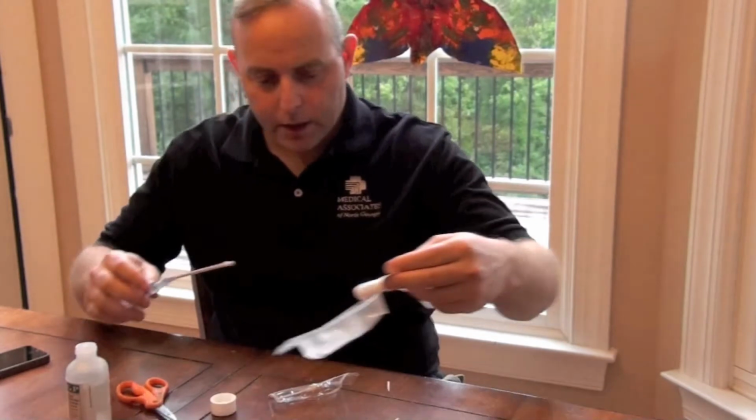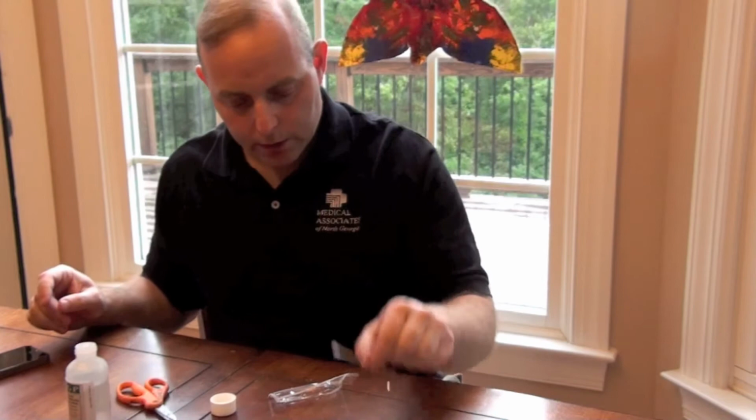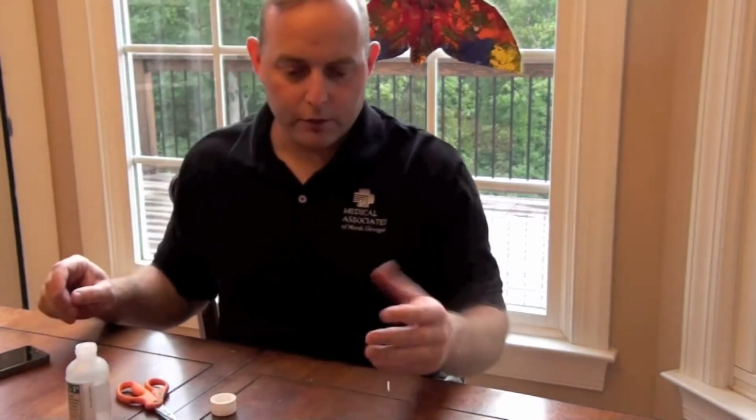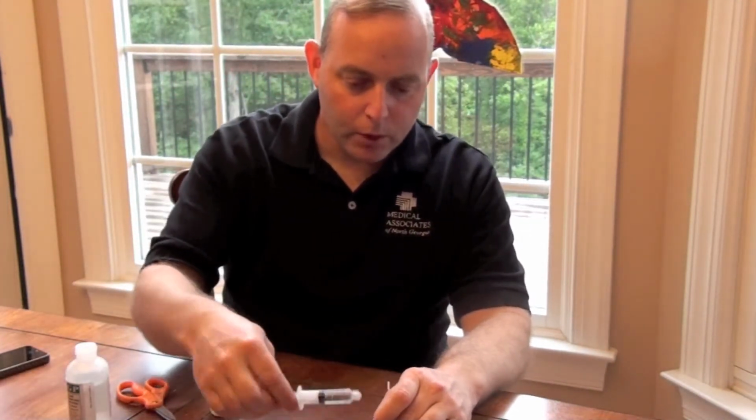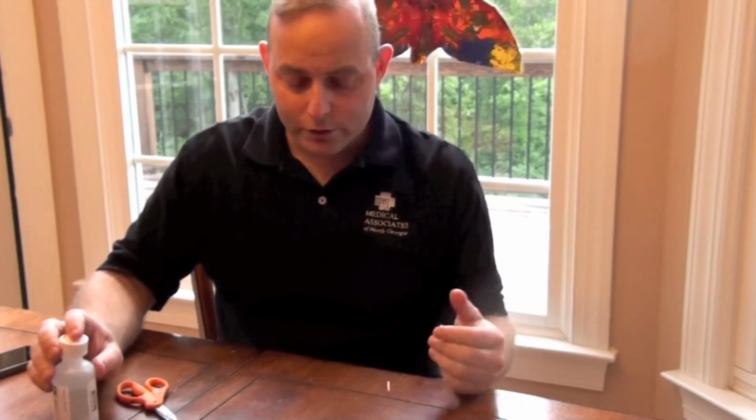The step that I did not perform initially is, while you are preparing the catheter and sterile tip applicator, you'll have the patient with the affected side take their syringe in the room with some paper towels and insert into an area and basically snort a little lidocaine, maybe a tiny sting, no flavor to it, but it'll help anesthetize the nose, so when we're inserting our cotton tip applicator, it's with minimal discomfort.